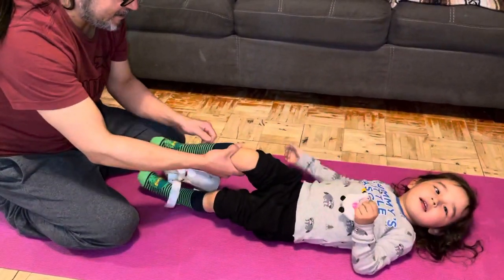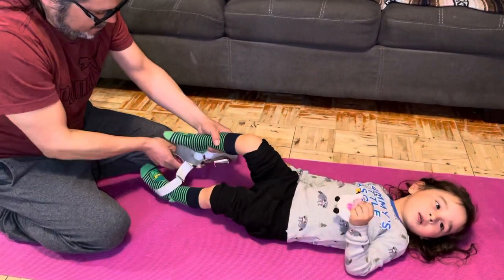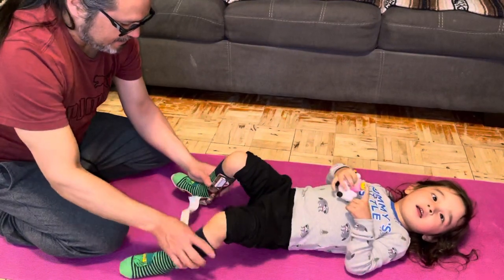You want to make sure that his socks are on as high as they'll go. Try not to have any creases on the socks. Then you want to bend his leg like that.